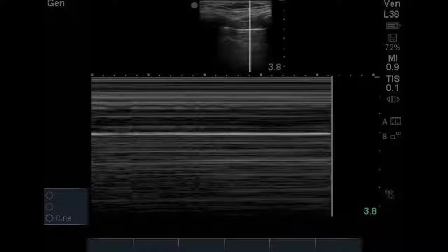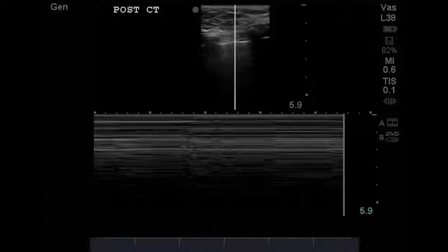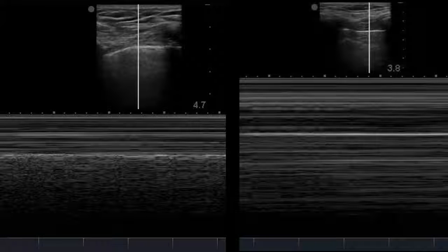If we were to drop an M-mode spike through that, you see the linear pattern of no movement in the chest wall, the pleural line, and a matched view of no movement below the pleural line, showing you absence of lung sliding and a pneumothorax, also referred to as a stratosphere sign. Here's another example of pneumothorax. You can see the pleural line. There is a little blip where the chest wall is moving, causing movement throughout the field and not just in the lung. Here you can differentiate between the two with lung sliding present on the left of your screen and pneumothorax present on the right.